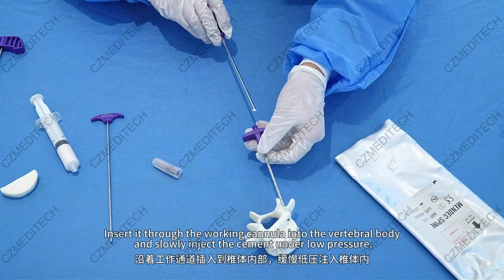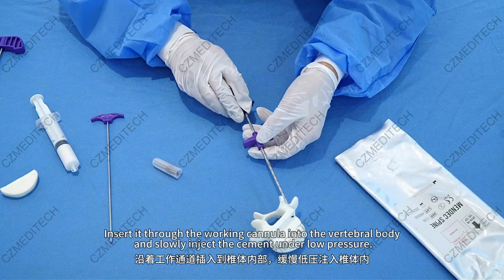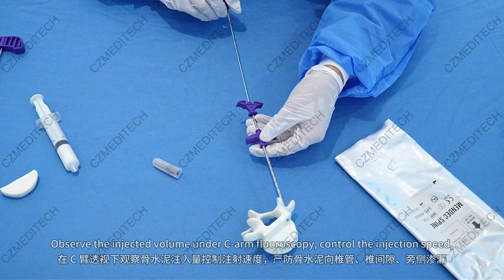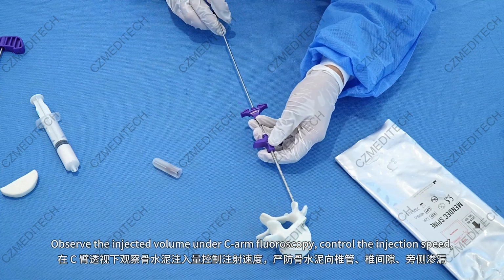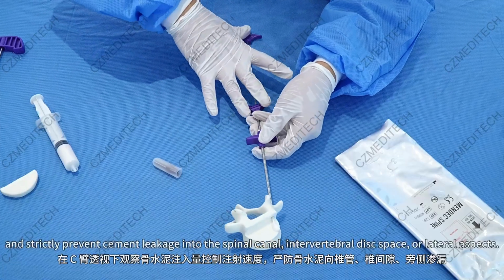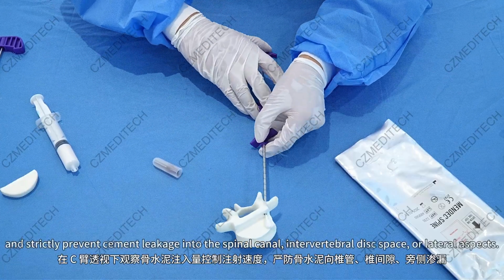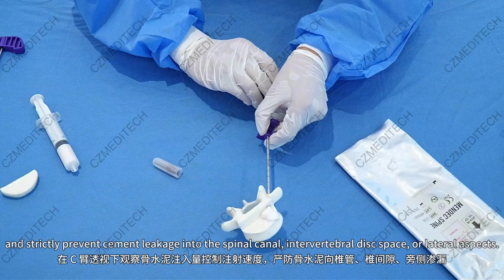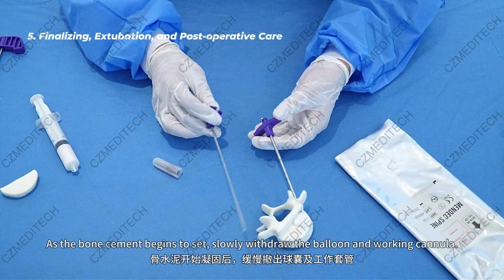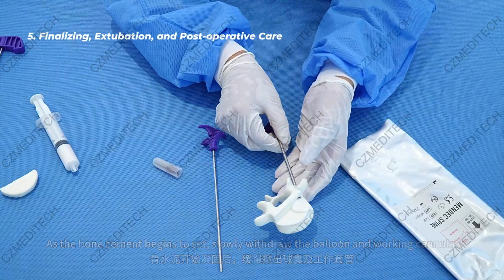Insert it through the working cannula into the vertebral body and slowly inject the cement under low pressure. Observe the injected volume under fluoroscopy, control the injection speed, and strictly prevent cement leakage into the spinal canal, intervertebral disc space, or lateral aspects. As the bone cement begins to set, slowly withdraw the balloon and working cannula.